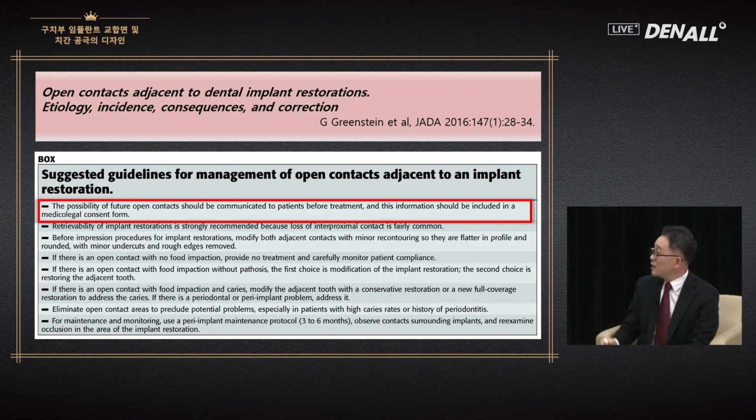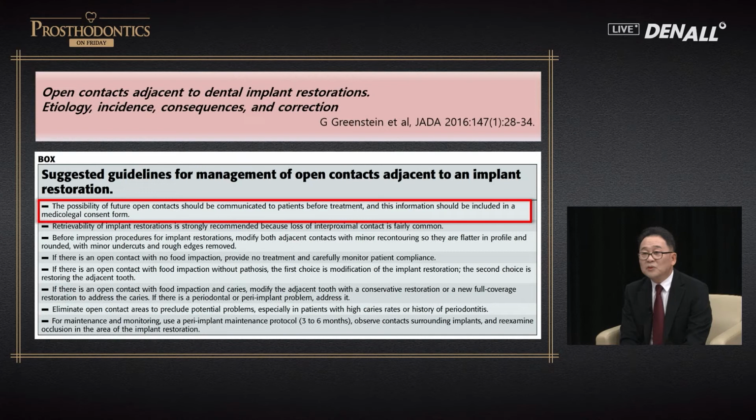Regarding the open contacts, the guideline is summarized here. If you read it, it talks about the retrievability of implants as well.